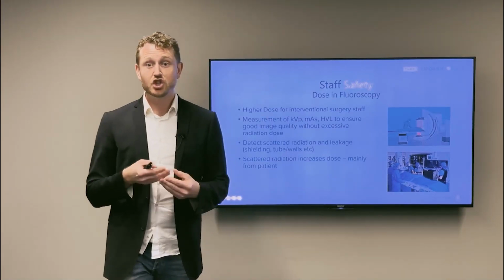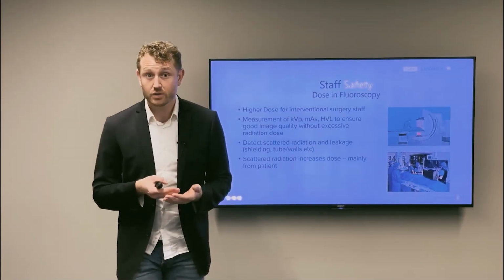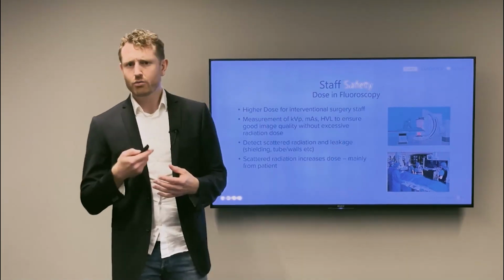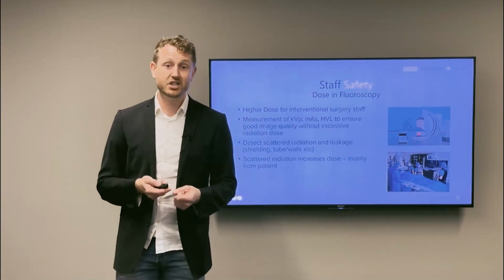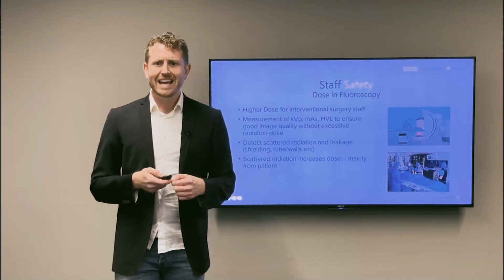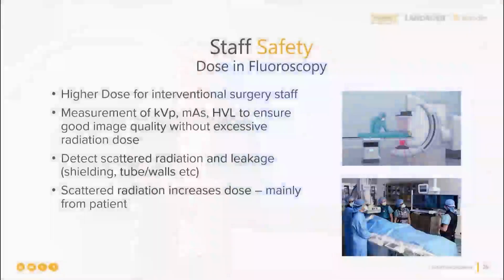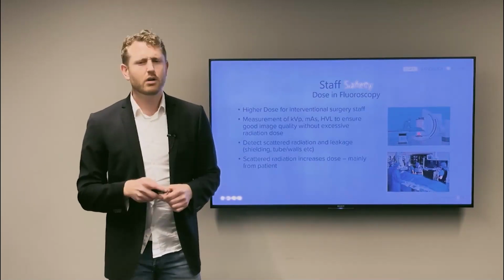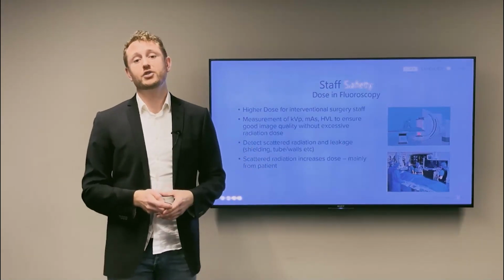If the machine gives more dose than required, the increased accumulated dose to the staff over years may be significantly higher. If there's something wrong and the machine gives a lot more dose than it should, it is also a danger for the patient. Not only does it increase long-term illness, it can also give short-term damage such as burns or dead tissue. Of course, tube and wall leakage in these types of rooms are also important, especially since the exposure time is so long compared to other modalities.